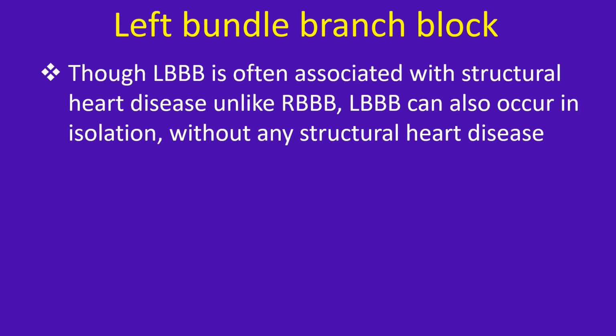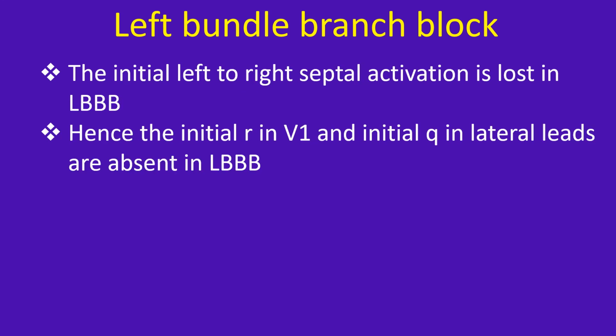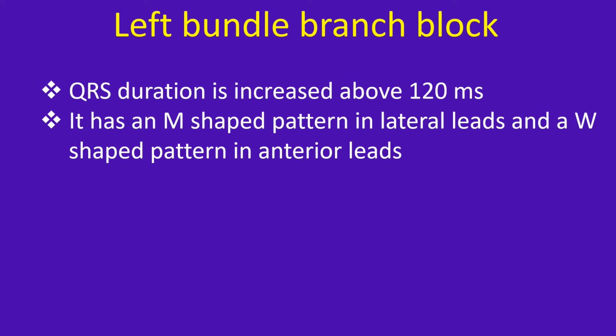Though LBBB is often associated with structural heart disease, unlike RBBB, LBBB can also occur in isolation without any structural heart disease. The initial left to right septal activation is lost in LBBB. Hence, the initial R in V1 and the initial Q in lateral leads are absent in LBBB. QRS duration is increased above 120 milliseconds. It has an M-shaped pattern in lateral leads and a W-shaped pattern in anterior leads.